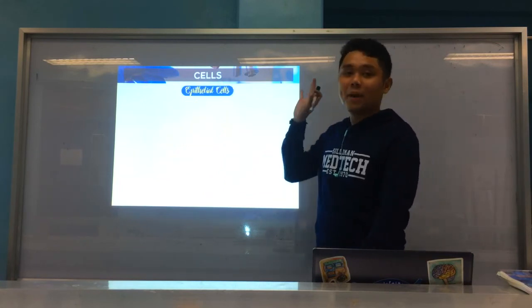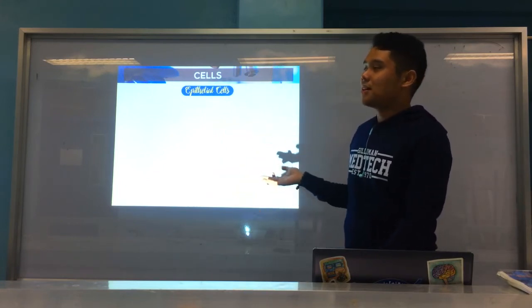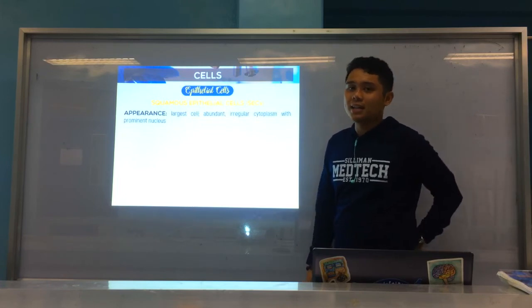Okay, so that's for the blood cells. Medyo gamay lang, di ba? From our red blood cells and white blood cells. Now, we go now to your epithelial cells. We start first, of course, with your squamous epithelial cells. It's the largest cell in your urine sediment.